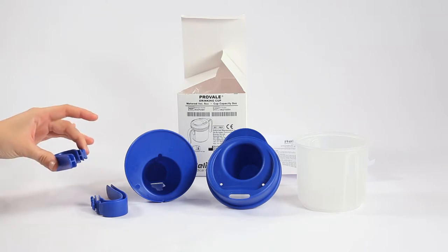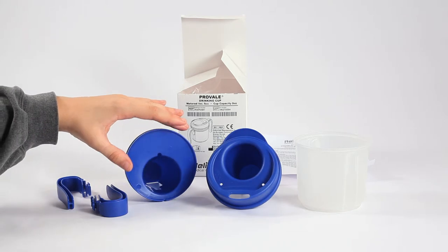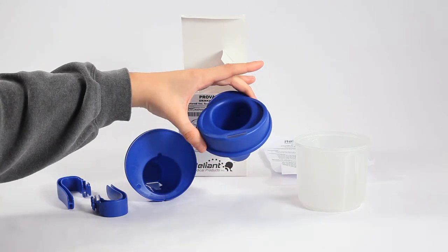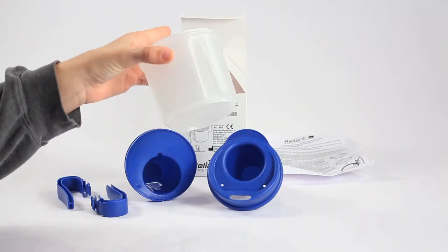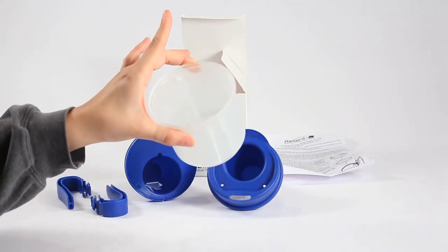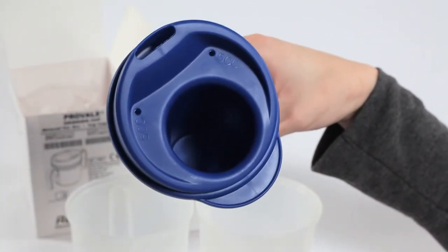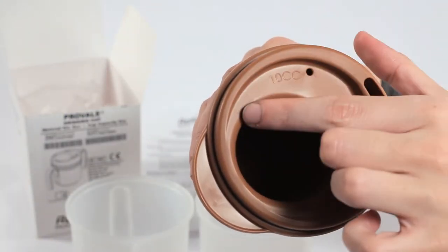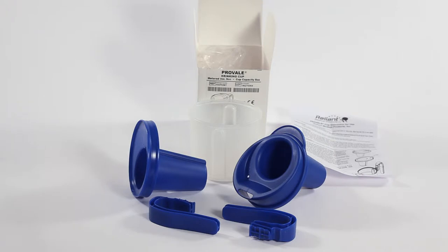Prior to assembling the cup, make sure all of the parts to be assembled — two handles, the lid, and the mid-cup — are all the same color, all blue or all brown, depending on the desired delivery size, with the exception of the clear outer cup, which can be used with either colored cup. The delivery size is printed on the top of the lid. Check that the proper delivery size is being assembled.